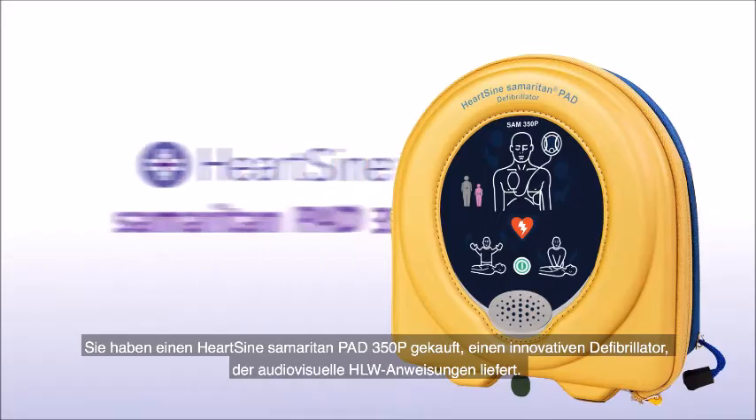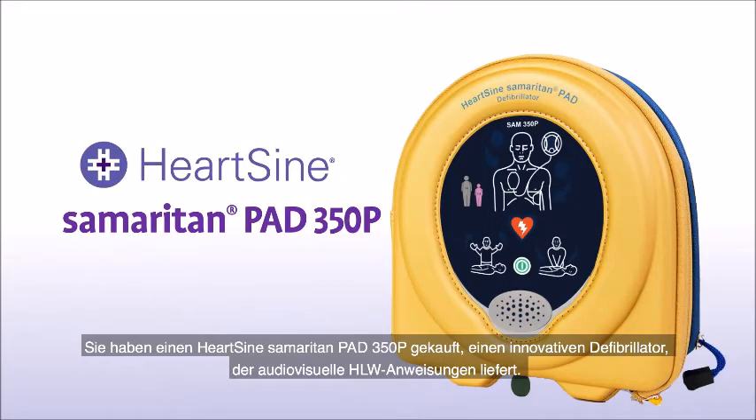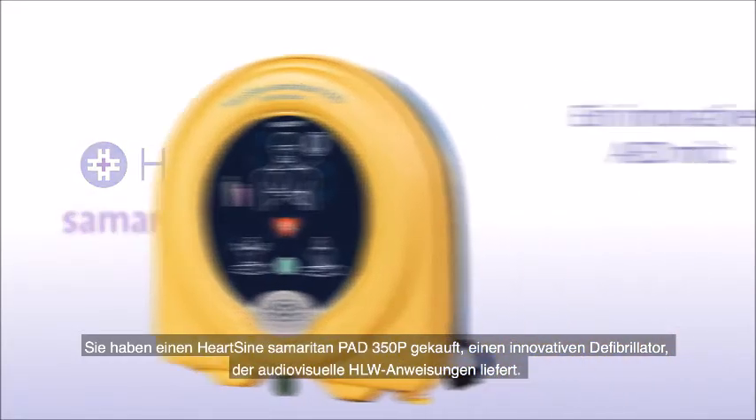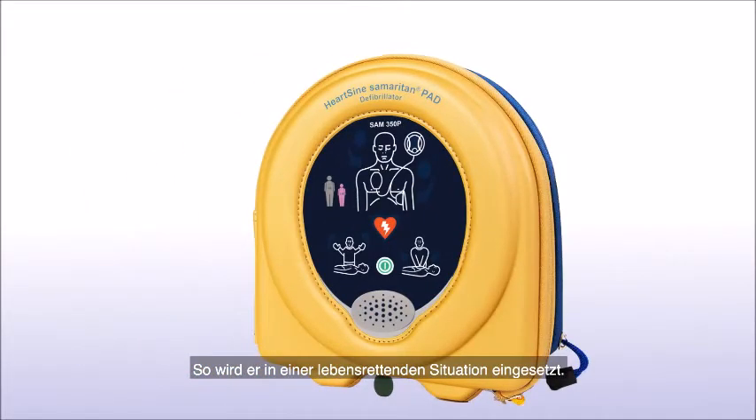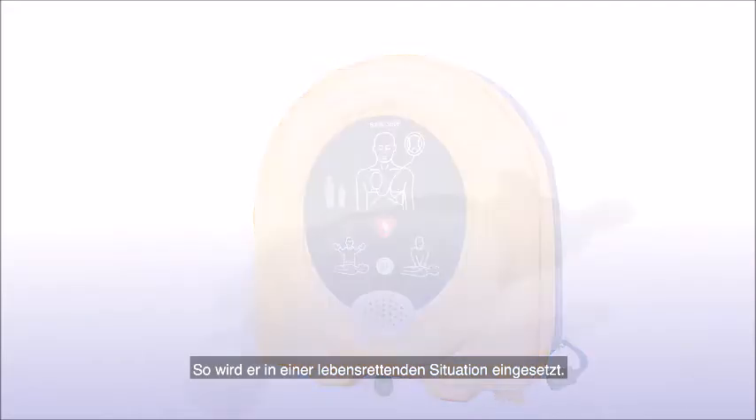You have purchased a HeartSign Samaritan PAD 350P, an innovative AED that provides audio-visual CPR coaching. Let's look at how to use one in a life-saving situation.